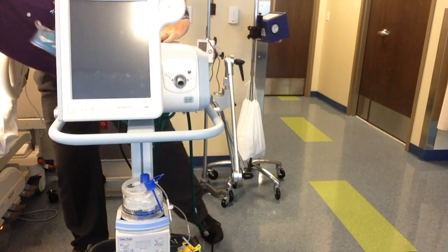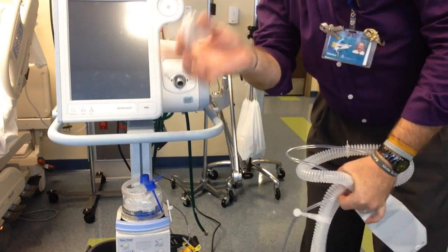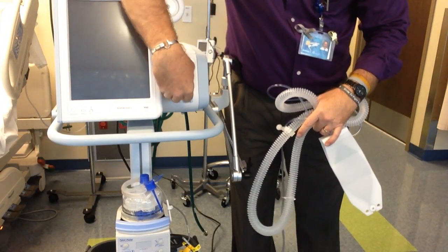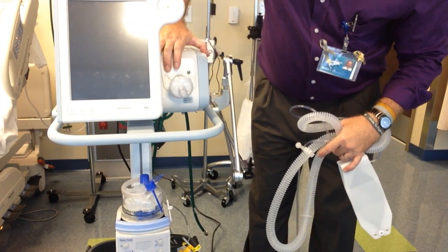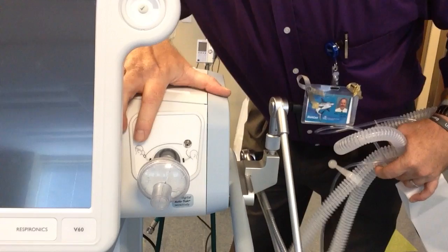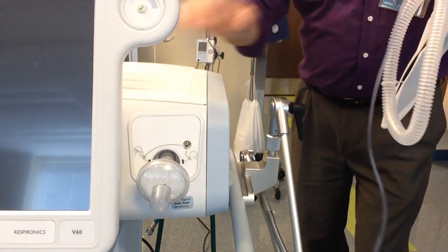Going over the circuit real quick. This is our circuit. Again, just like with the Mark 8, we're going to put a bacterial static, viral static filter on the output to the patient. This also has pictures on it so you can see mask. If the patient is on a mask, move this up so you can see it. If the patient is on a mask, then that extra hose goes there on the pressure port. If they're on an ET tube, again, the pressure port.